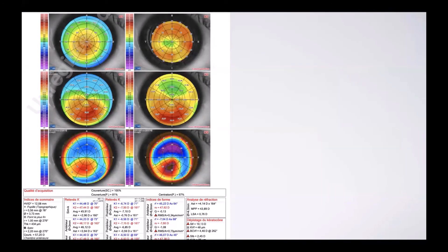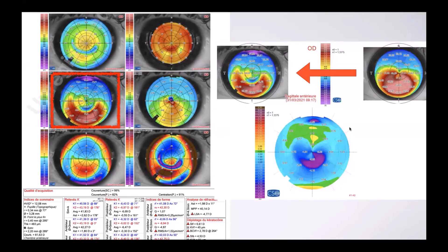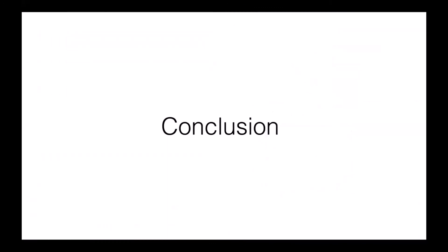This is the last example. Before the surgery, after putting the ring. Here we see the differential map with the area of action of the ring, which is really in front of the axis chosen before the surgery.